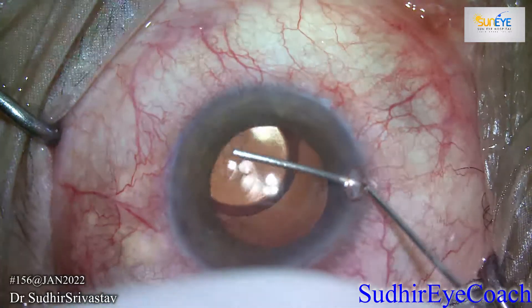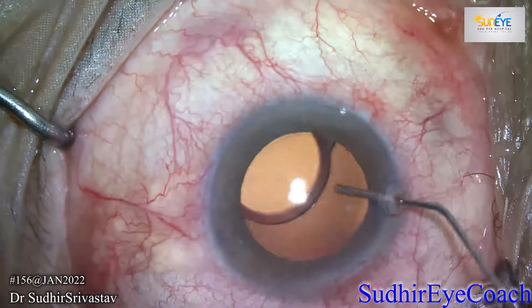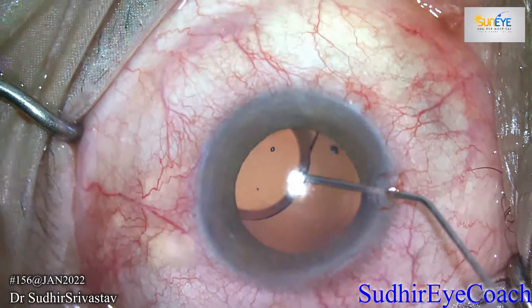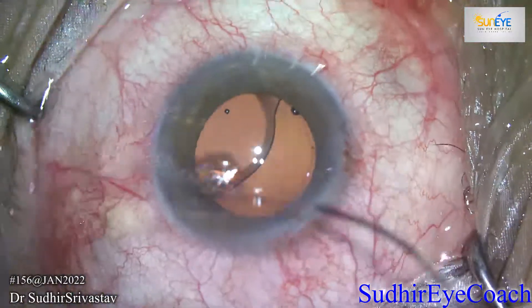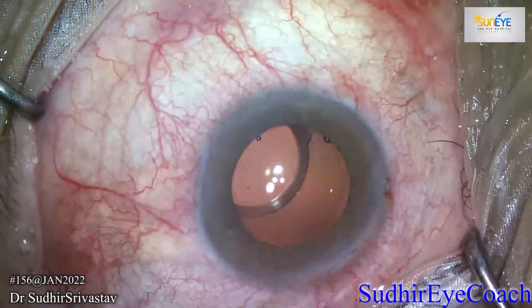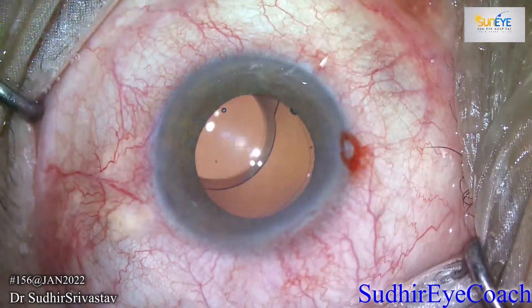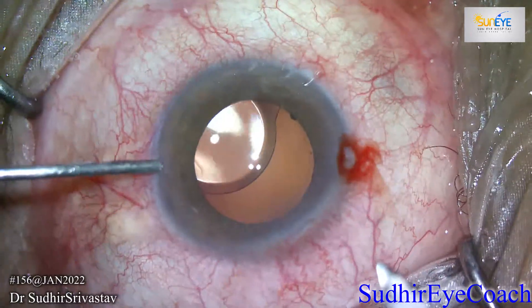This patient was operated elsewhere and presented with diplopia in the post-op. On examination, we found a sunken IOL. The posterior capsule was absolutely normal, so we decided to reposition the IOL. We reopened the side port incisions.